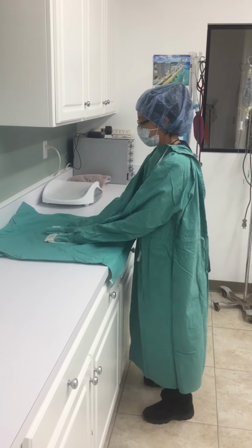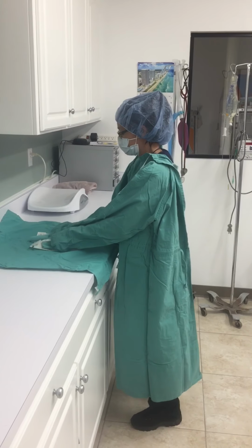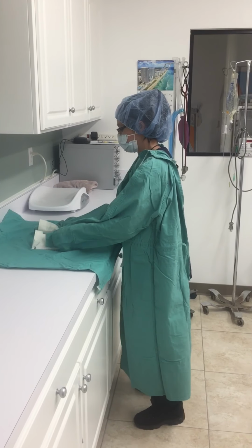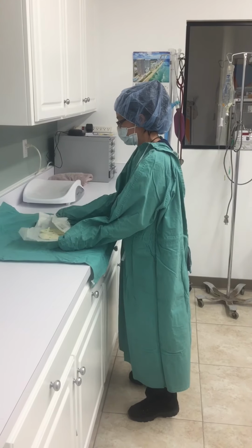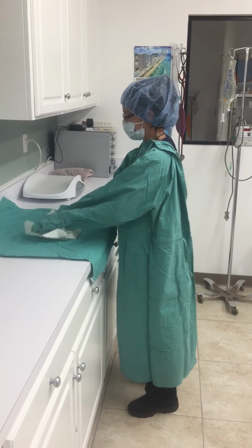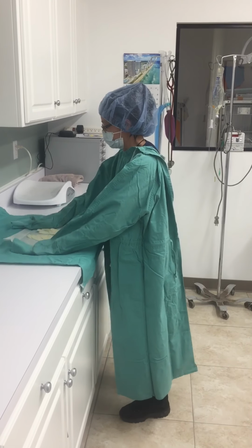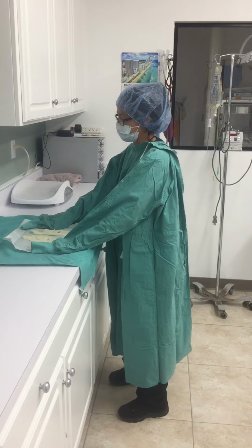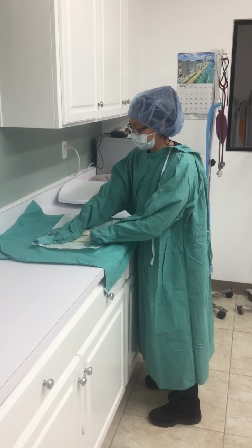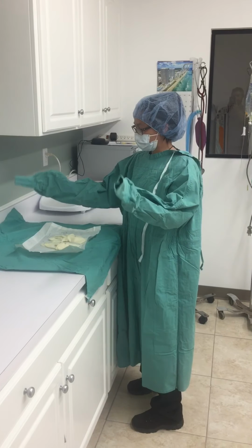I'm going to open up our pack here and flatten this out. Alright, what I like to do before I start gloving is I'll hold this back side, hold the fingers, and give it a little tug just to give it a little stretch. Kind of loosens it up for you.